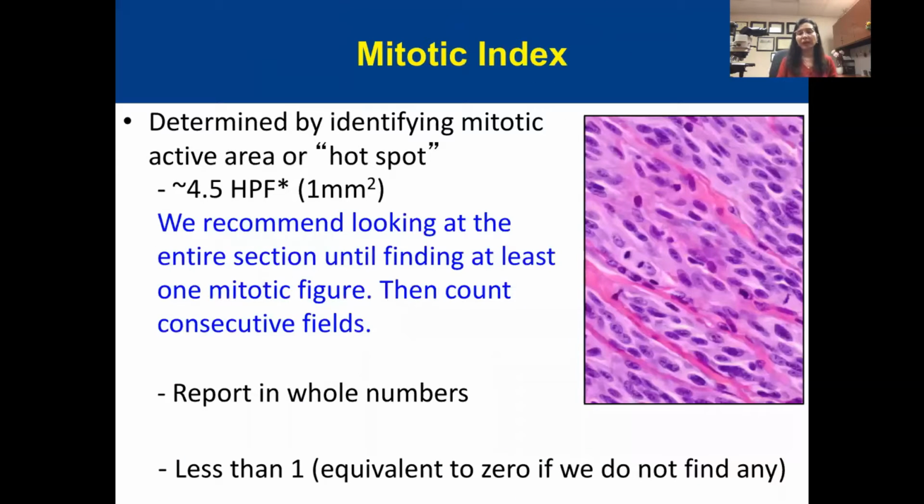Okay. Let me move to mitotic index. So this is another thing. Most of the time we see a discrepancy when we review the outside submitted pathology cases. So to count the mitotic figure, first you have to look for the hotspot. So hotspots means, in low power, we screen the whole section until we find an area with a possible highest number of mitotic activity. And then we have to count in 1 millimeter square area. So 1 millimeter square area, how can you calculate that?